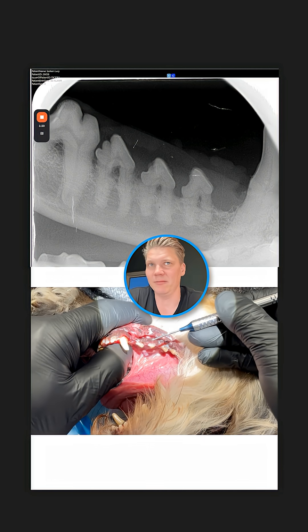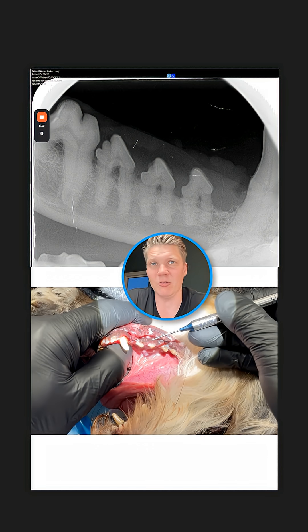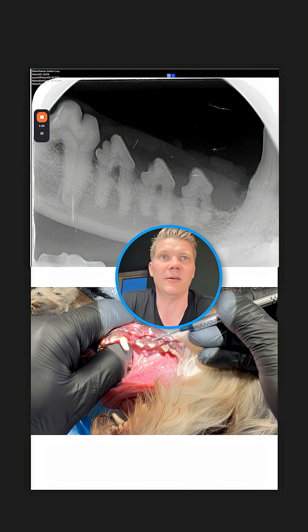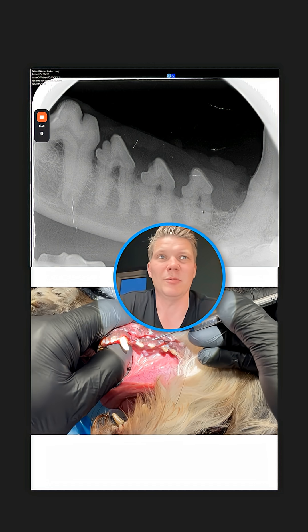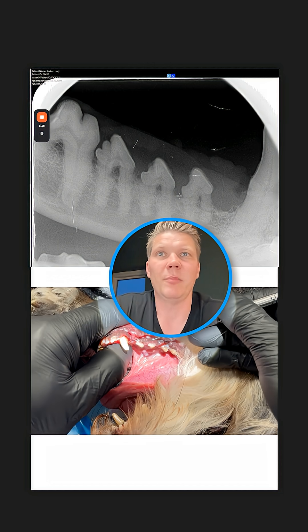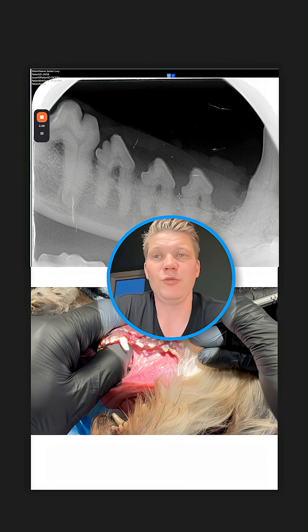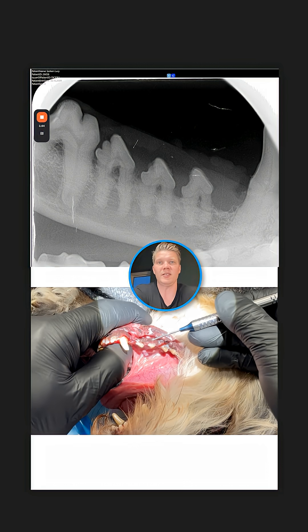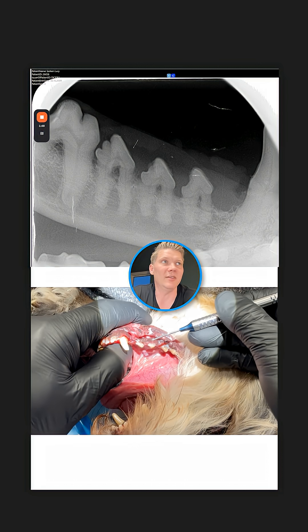You don't have to extract teeth when there's ankylosis — ankylosis is fine, it doesn't matter. You see that in most old dogs. Tooth resorption in the roots is also okay, but as soon as it approaches the crown and the oral cavity, that's when you have a problem.